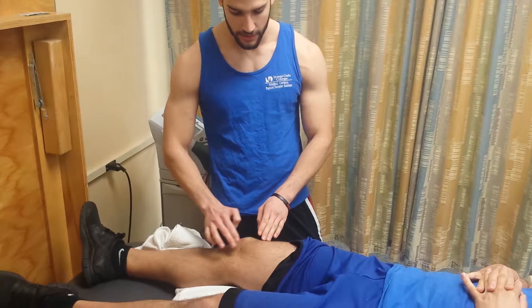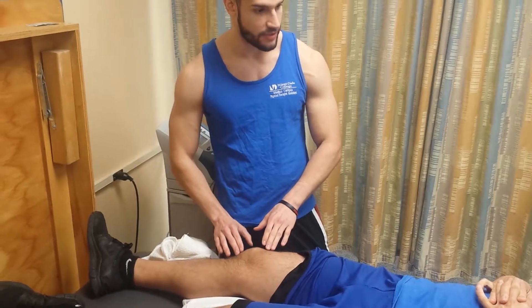Can you feel this? Yes? So no pain or anything? It's feeling the same? Perfect. And that's ultrasound.